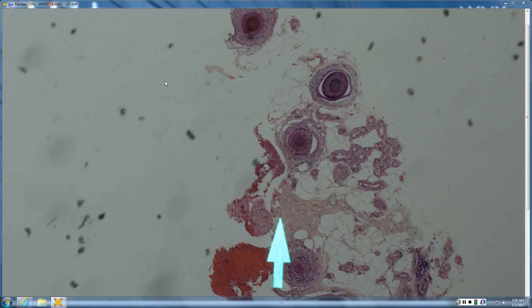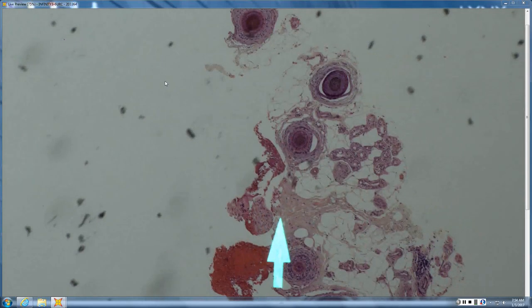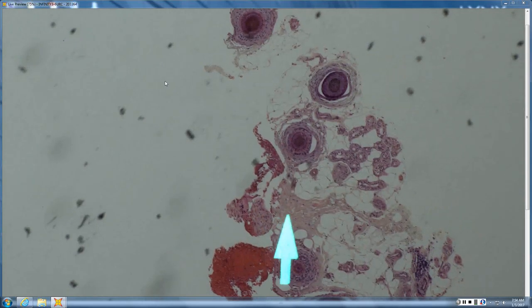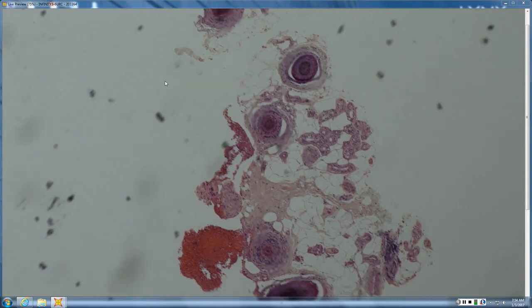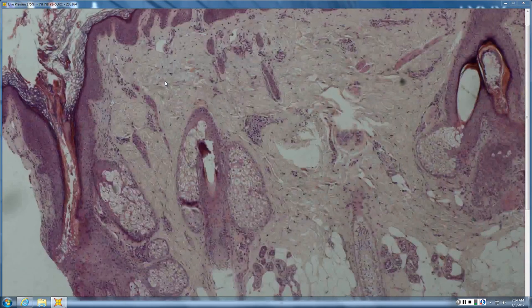Looks like there's a little horizontal cross-section there. Yeah, a little cross-section. It looks pretty deep in the fat, a little bit of inflammation. Yep. What do you think about the diameter of your hairs? They look smaller. Yeah, they're small. So what things give you miniaturization? AA and syphilis, I guess, and then also patterns. Yep. AA, pattern, and syphilis. So that's kind of your differential for miniaturization.